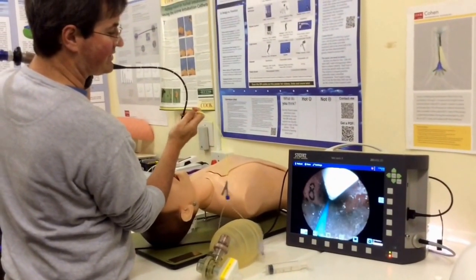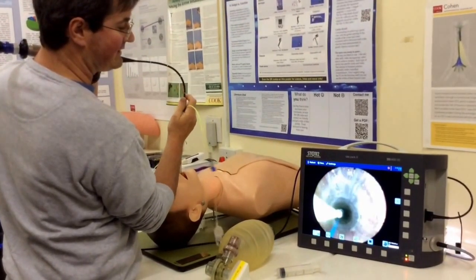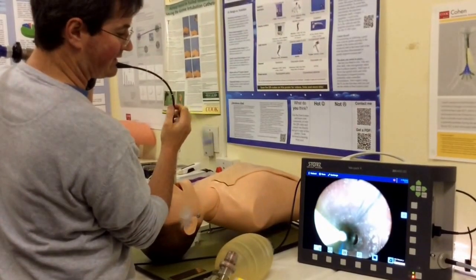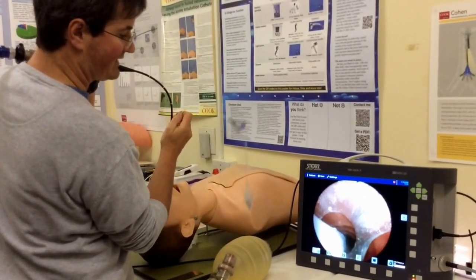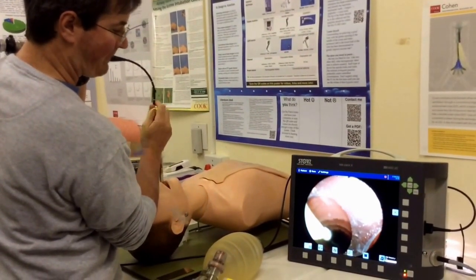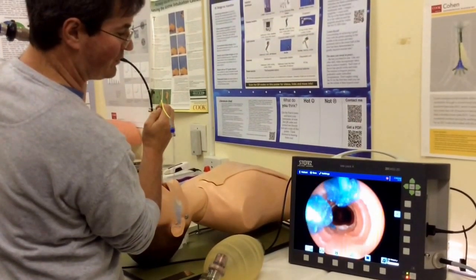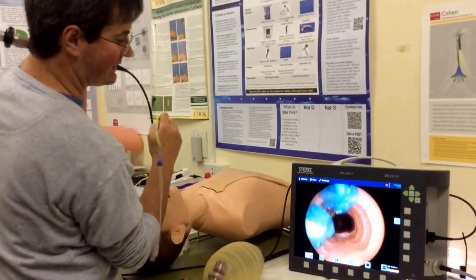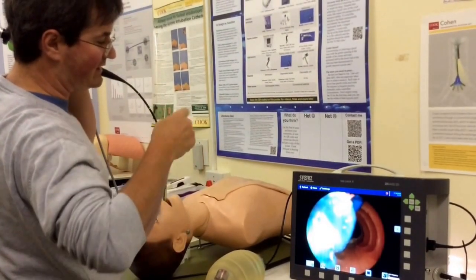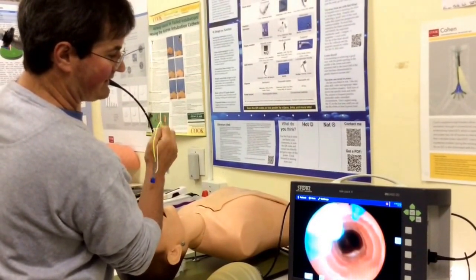The hub is not yet out of the ET tube. It's helpful to have an assistant, though when you're skilled you can do it by yourself. When putting the fibroscope through, be careful of a little step as you enter the ET tube — you don't want to force the tip of the scope against that step and bend the scope. If you're struggling with the orientation, put a bit of rotation on the bronchial blocker and it should advance.